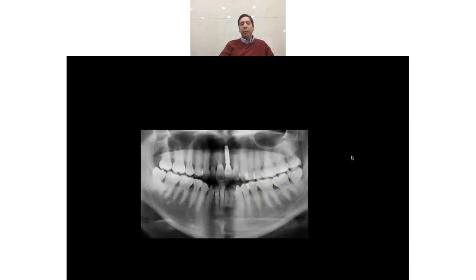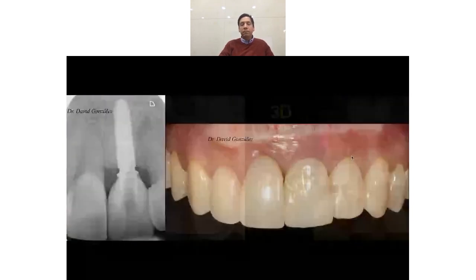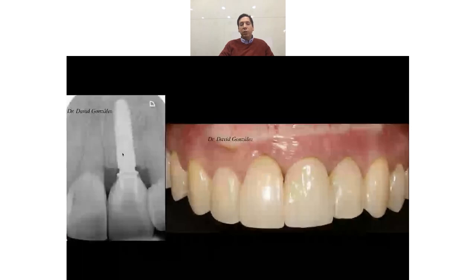This is a panoramic X-ray. And I want you to keep this in mind. We can obtain this by doing the split bone block technique, doing this protocol that was invented by Professor Khoury. This is the final result. An implant in perfect position with beautiful bone, radiopaque, and this nice soft tissue contour. And of course, we also needed some help with composite in the adjacent teeth.